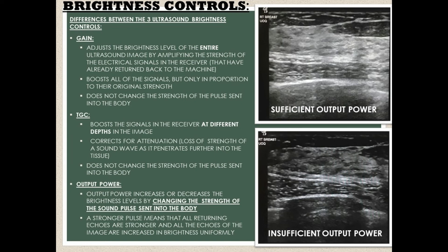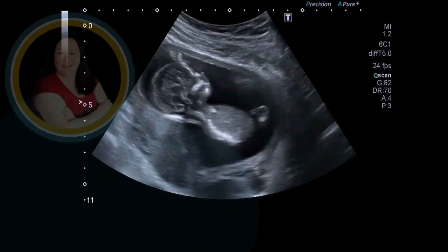When adjusting these brightness controls, always keep in mind the ultrasound safety principle of ALARA — as low as reasonably achievable. These same brightness levels could be achieved by adjusting the TGC or the gain, neither of which change the strength of the sound pulse that's sent into the body.